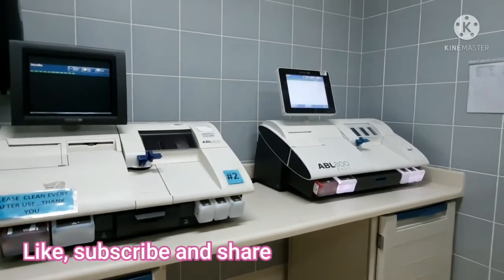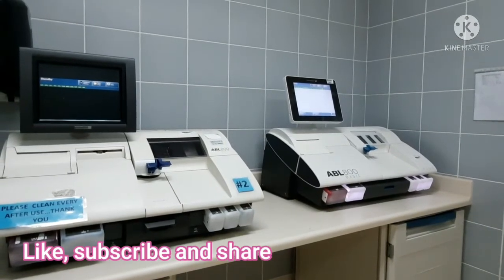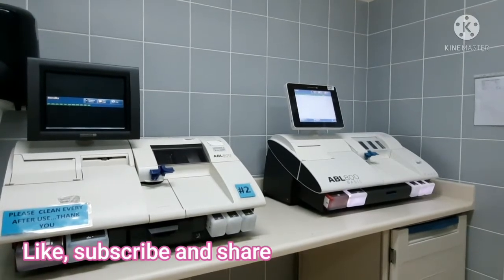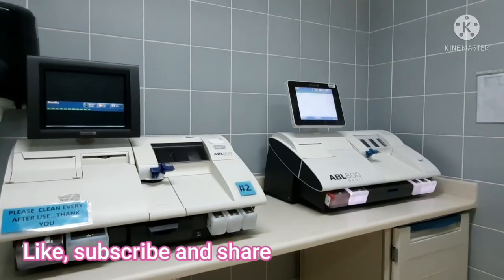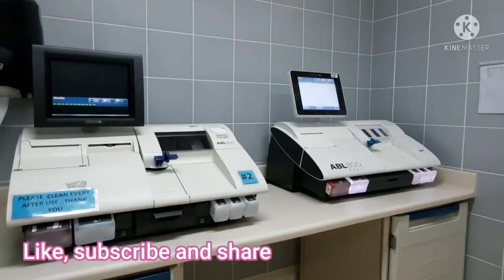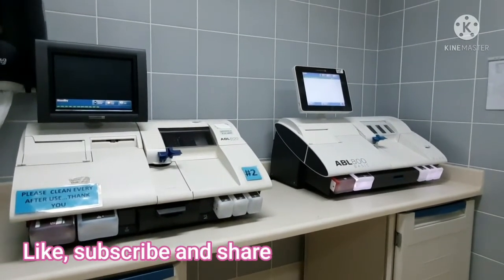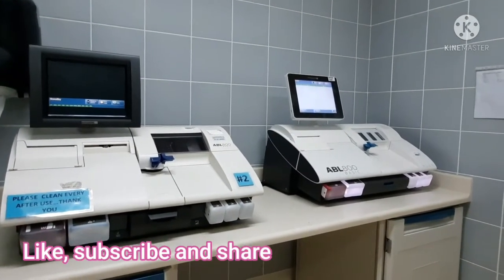So in our unit, we have two blood gas machines, and both of them are functional, because most of our patients are critical. And we are always using this machine to determine the acid-base balance of the patient so that the doctor can intervene or can plan for any interventions for the patient.